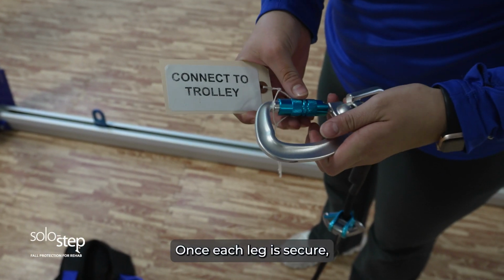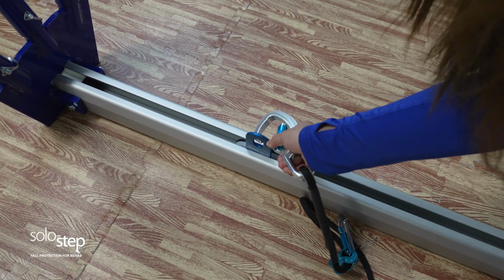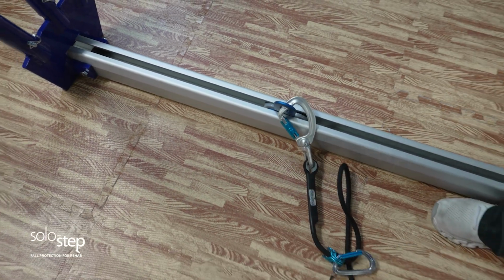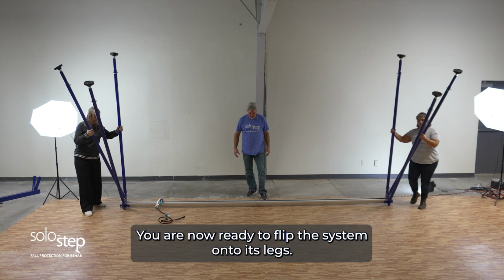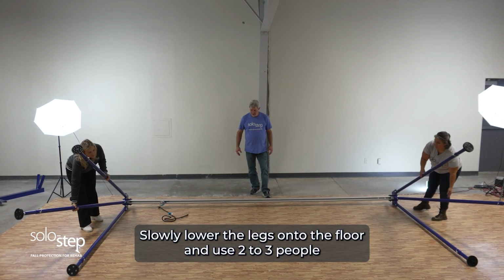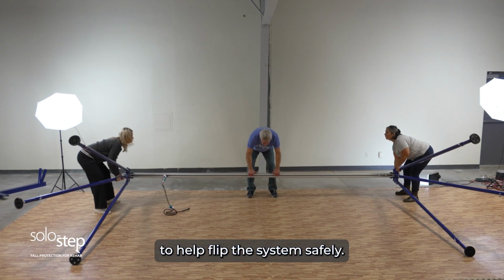Once each leg is secure, you can connect the lanyard to the Solo-Step trolley. You are now ready to flip the system onto its legs. Slowly lower the legs onto the floor and use 2 to 3 people to help flip the system safely.